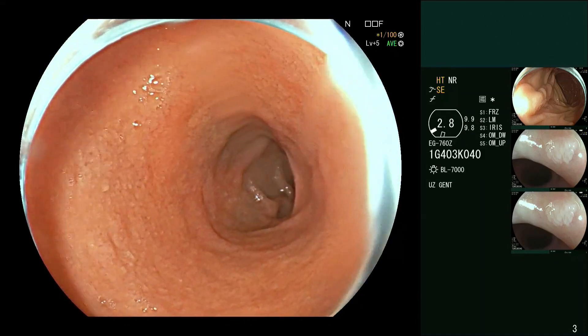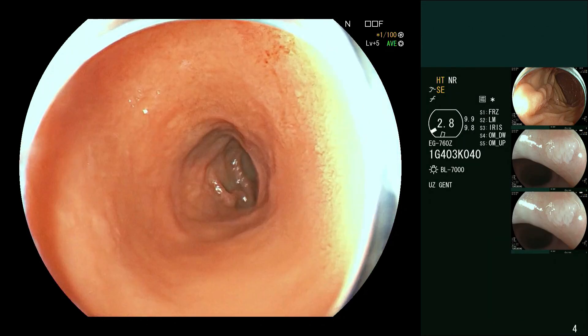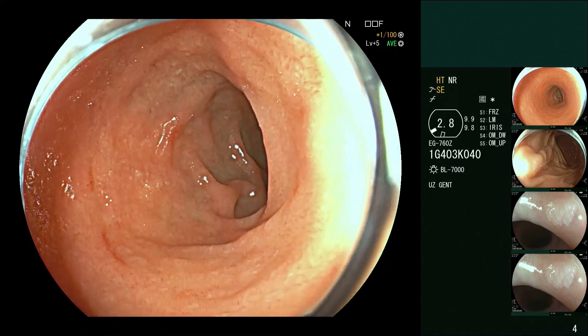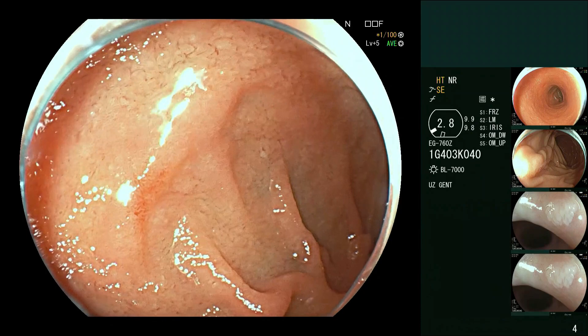That push in there is nice to get a good view of the duodenal bulb. I'm into freezing the image, having a look, spending a little bit of time, and then doing this — it's a good technique for patients who are moving around as well. Here we have a little bit of maybe a potential erosion, but nothing else.